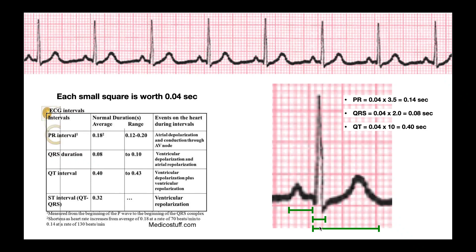Now, I usually start here not counting the halves. I count the full boxes, and then I add on any halves on the end. So here's the first full box. One, two, three, four, five, six, seven, eight, nine. Here's a half. Here's another half. So nine plus two halves is 10 full boxes. So 10 full boxes times 0.04. This gives me 0.40 seconds.